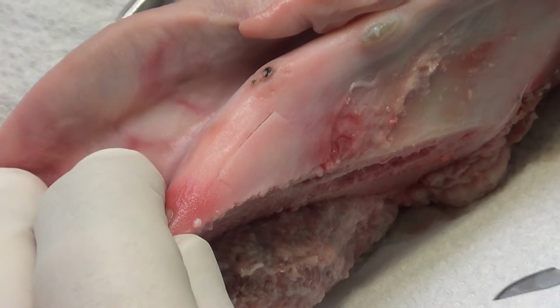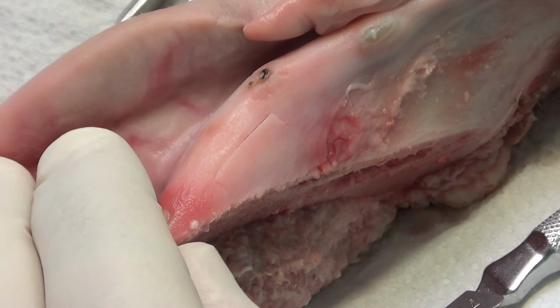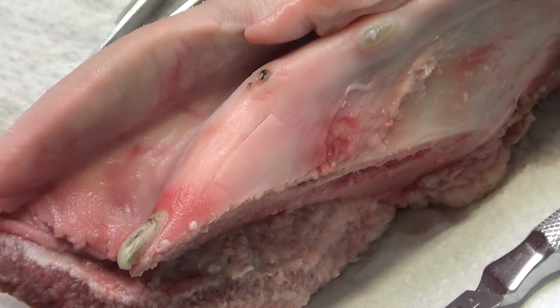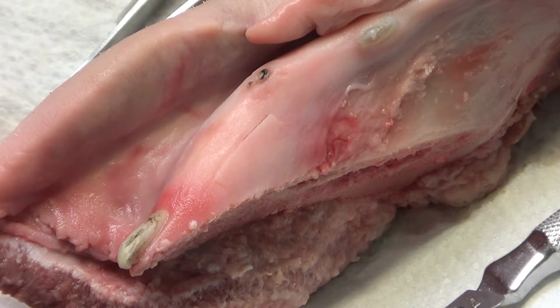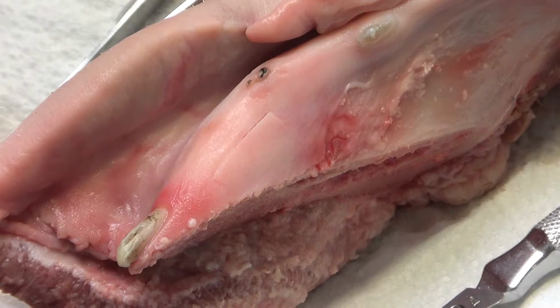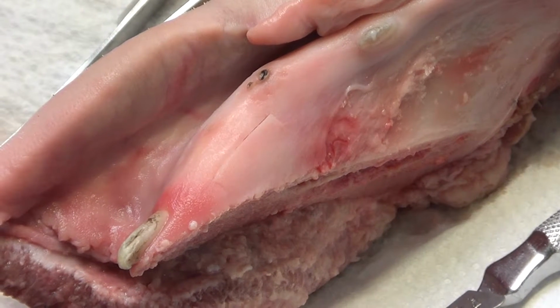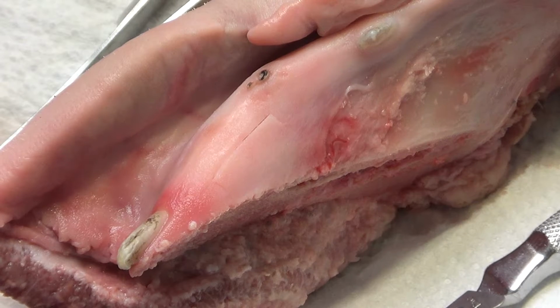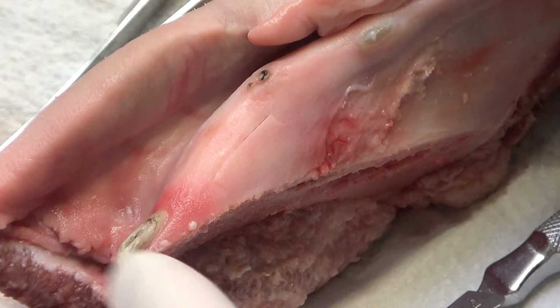Do you need some help to maintain the lower jaw stable? If you need help, I'm here. Or here. Yeah, perfect. But you don't have to be afraid. You see that here you need to cut a little bit more, and also here.